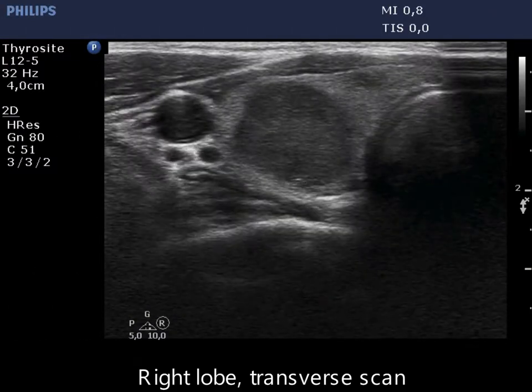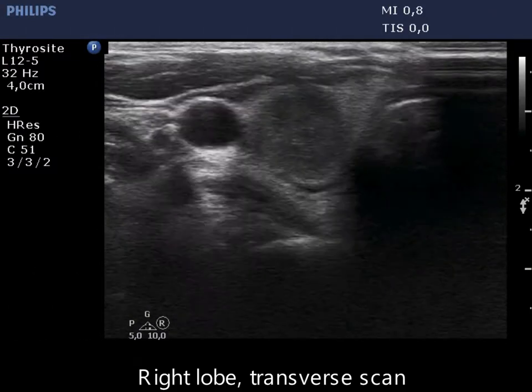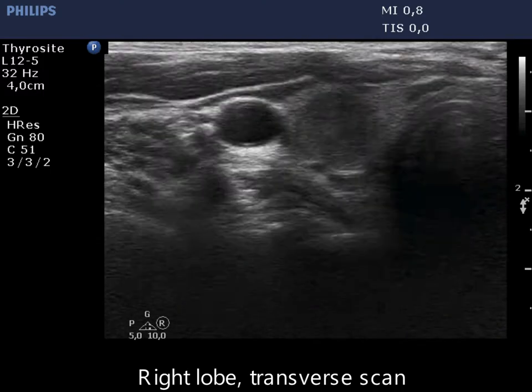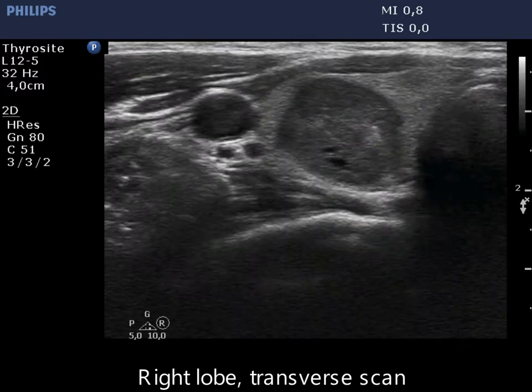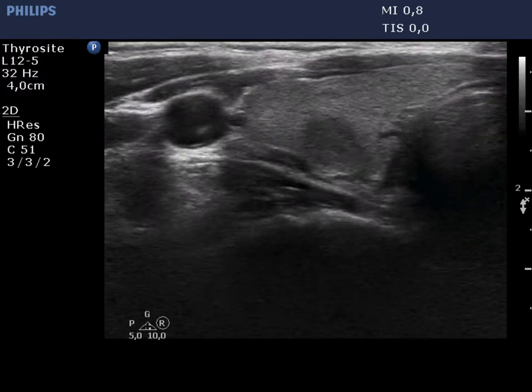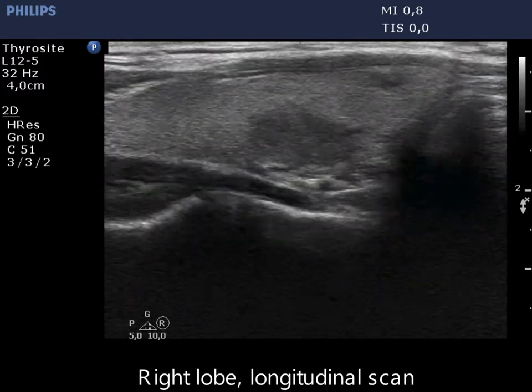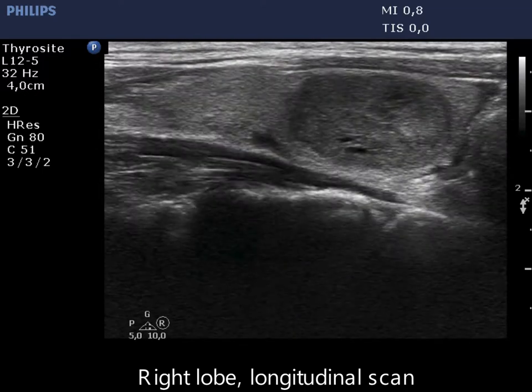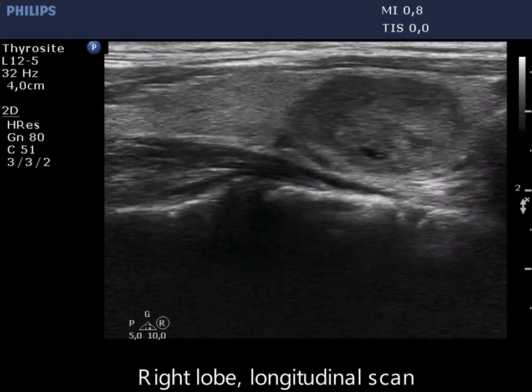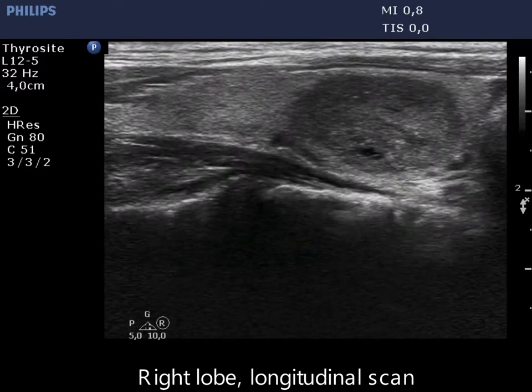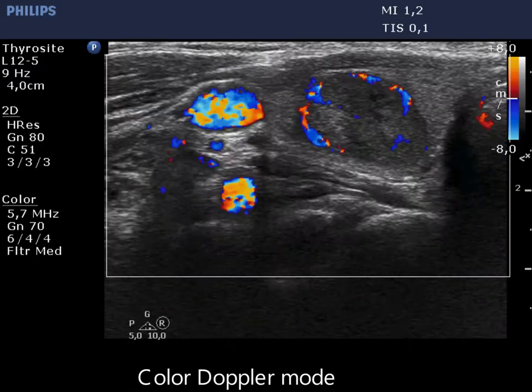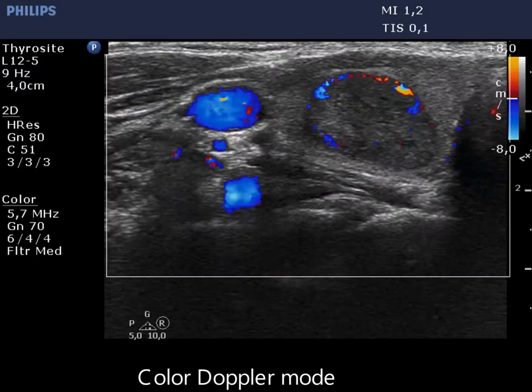There is a hypochogenic mass in the right lobe which presents undulation in the surface. The nodule displays paranodular blood flow.